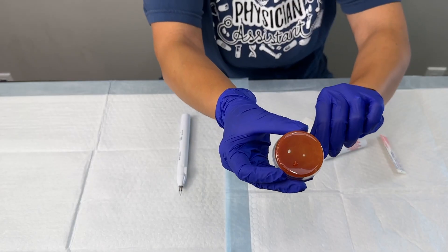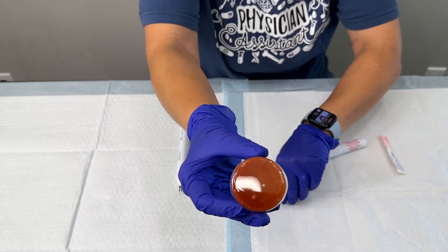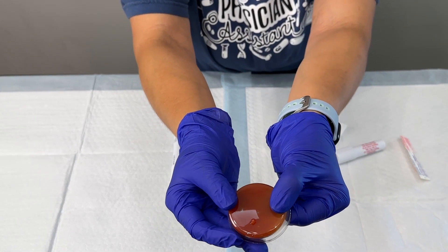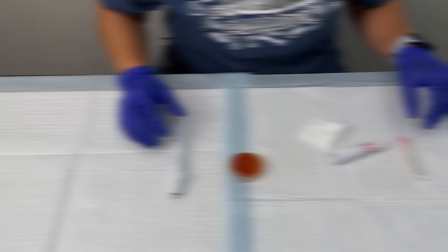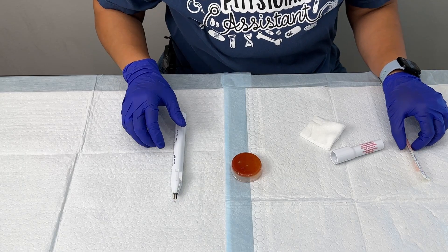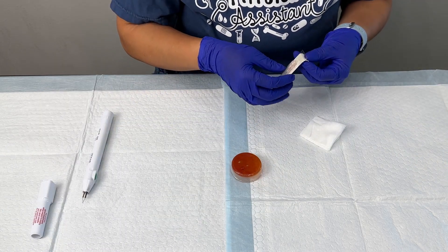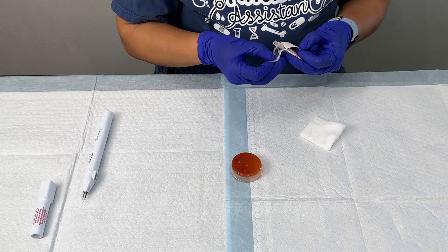I just wanted to show you the nail and a little bit of blood that we got out of that nail — you can see that there. Now we're going to proceed with the second technique to evacuating a subungual hematoma, and that is using an 18 gauge needle.